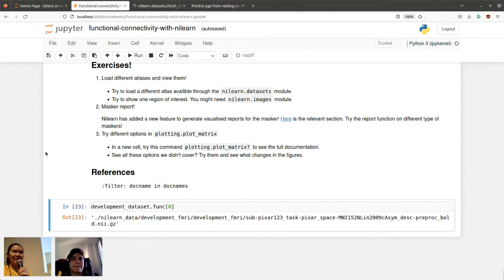Yep, we have a question on site. Fantastic. If you're doing parcellation with a functional atlas, does it look at the activation in the image that you give, and then try to figure out the functional connectivities in the image that you're giving as input, and then apply that atlas on it? Or are the parcellations or regions predefined, using functional connectivity from other images, and then those are applied to the image that you give?